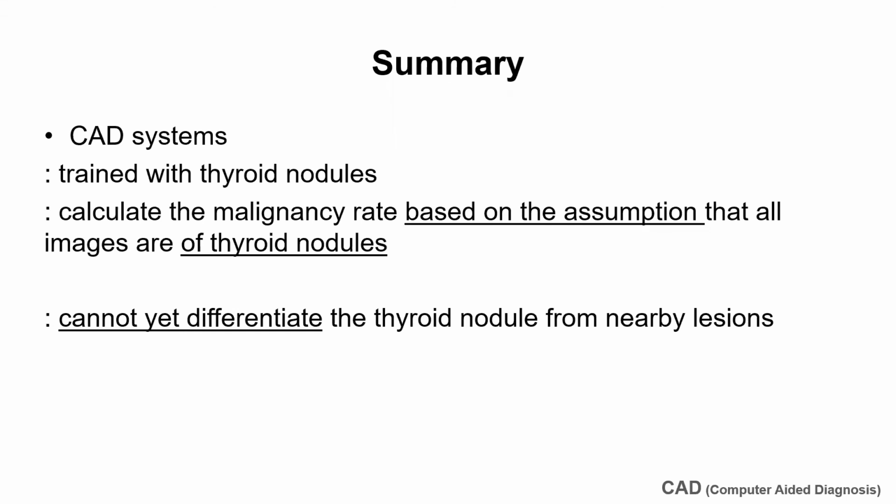For beginning readers, CAD is a way to improve diagnostic performance. However, the CAD systems of today were trained with thyroid nodules and calculate the malignancy rate based on the assumption that all images are of thyroid nodules. Therefore, when the lesion in question is not a thyroid nodule and high malignancy values are calculated by CAD, an invasive procedure may be performed at the lesion, which can even be a leave-me-alone lesion.